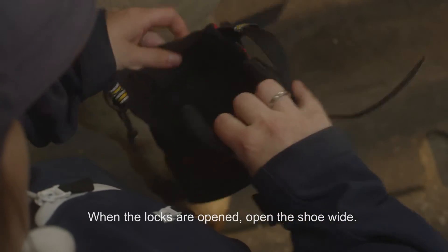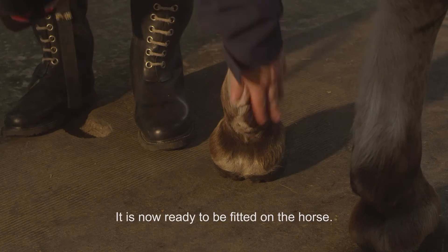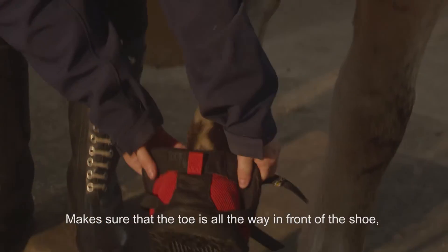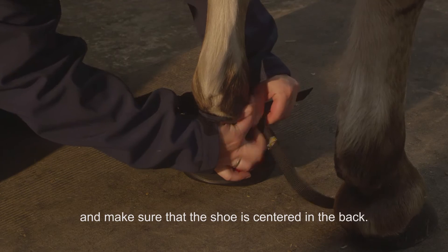When the locks are opened, open the shoe wide. It is now ready to be fitted on the horse. Pick up the hoof and place the shoe on the hoof. Make sure that the toe is all the way in front of the shoe and make sure that the shoe is centered in the back.